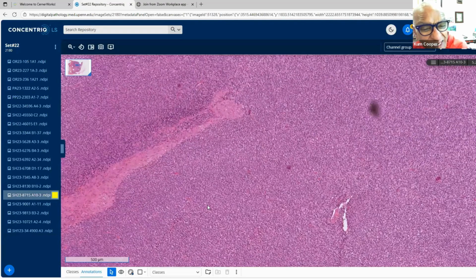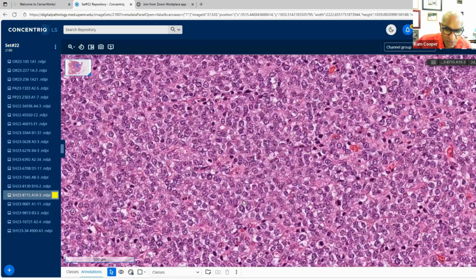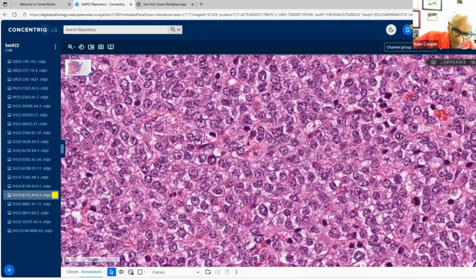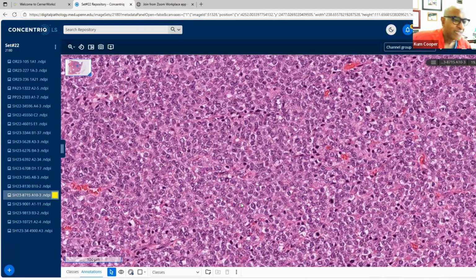These cells are epithelial negative, keratin negative, and germ cell markers were negative as well. So SALL4, SOX10, I beg your pardon, OCT3-4 and SALL4 were negative for seminoma. Now, there's another, for the spiroadenoma, epithelial markers were negative, alveolar soft part, metastatic germ. Okay, we just addressed that.